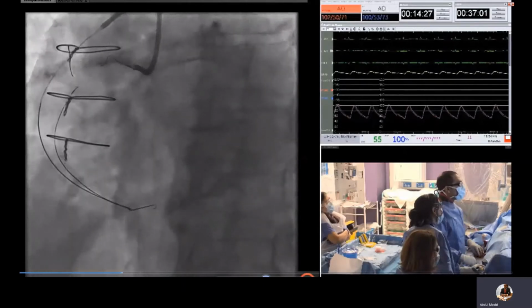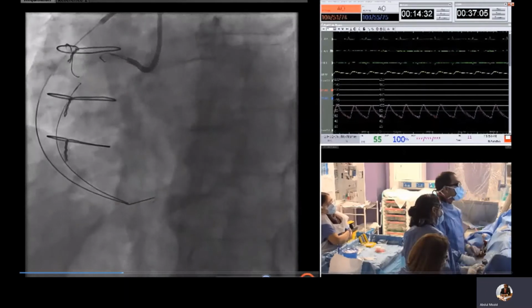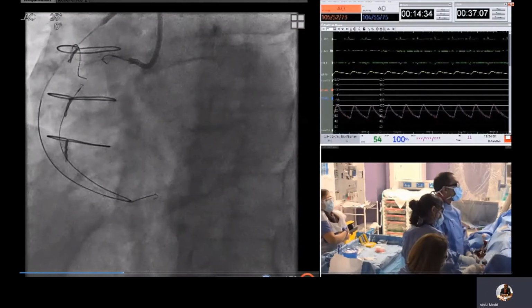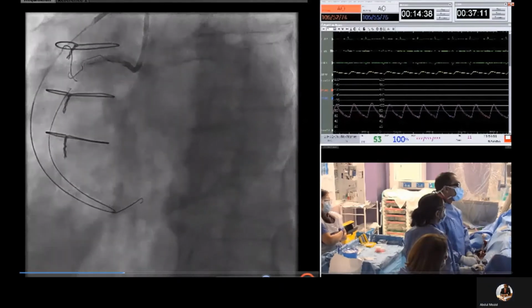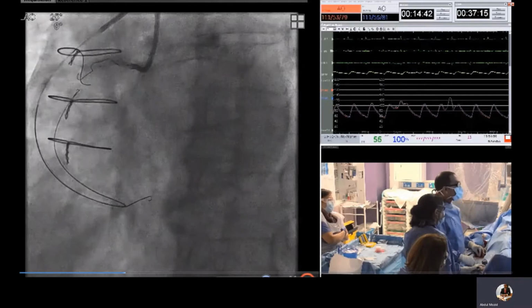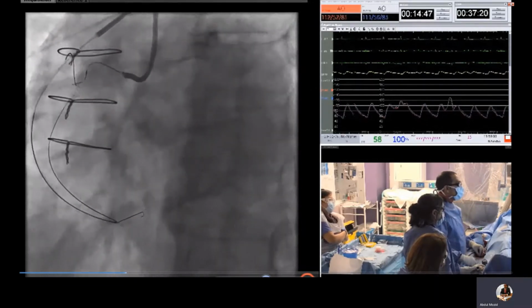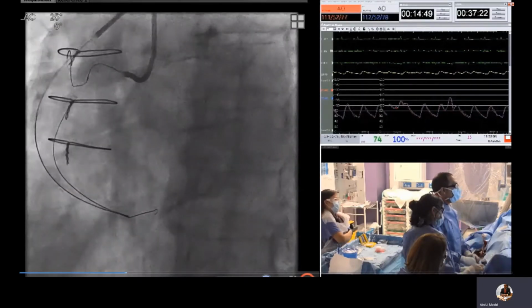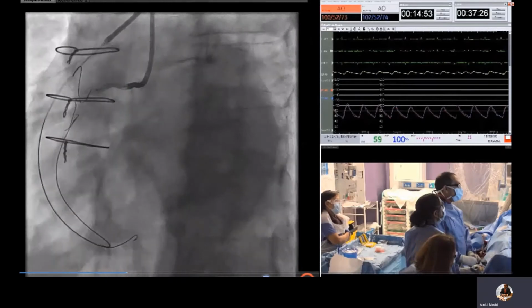So here is a 3mm NC balloon inflating in the proximal vessel. You can see the wire there enters the subintimal space, and the Mamba Flex is advanced with it. So here clearly you can see that there is some lucency between the wire and the balloon, and that's clearly in the subintimal space. And the Mamba Flex catheter is able to easily advance into here.